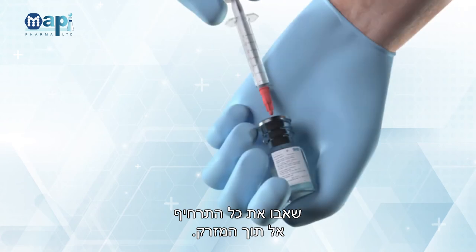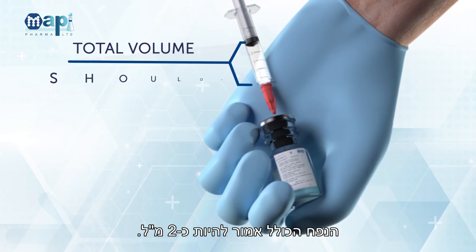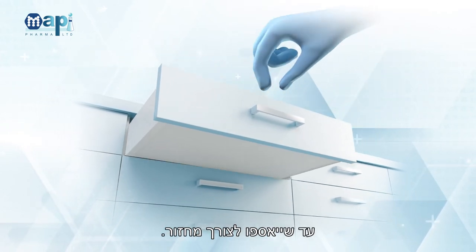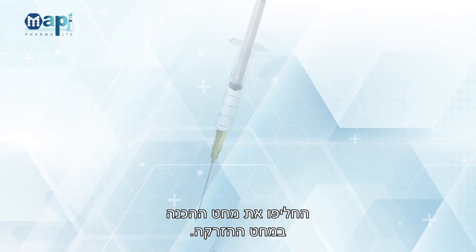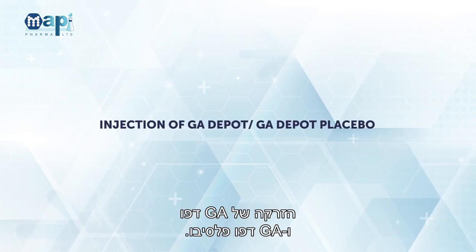Withdraw all the suspension into the syringe. Total volume should be about 2 mL. Keep the used vials in a closed cabinet until pickup for reconciliation. Replace the suspension needle with the injection needle.